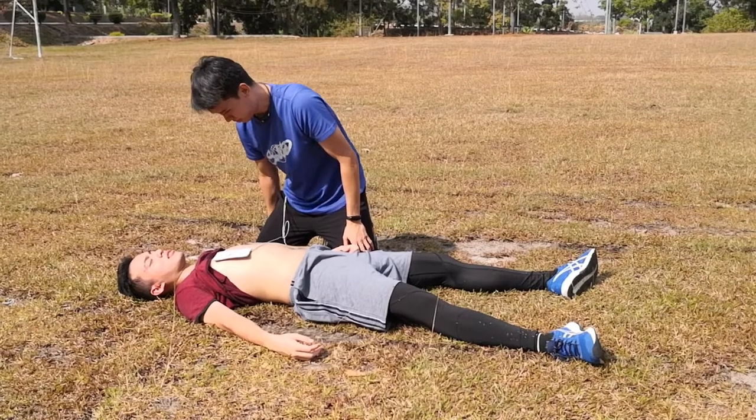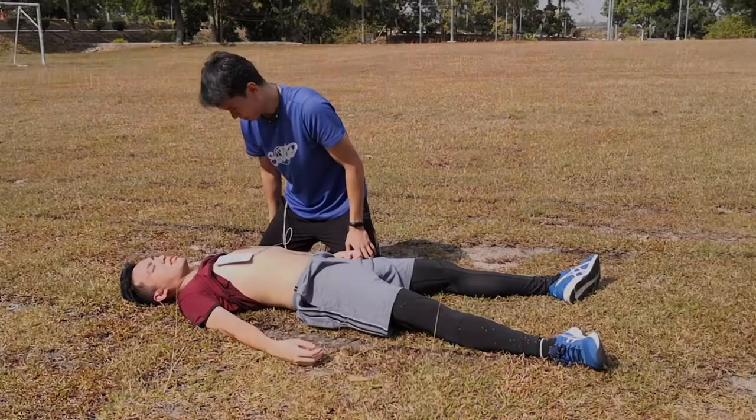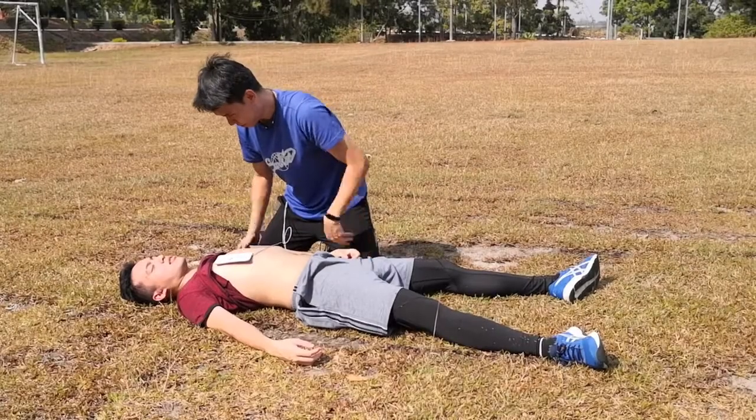Shock will be delivered in 3, 2, 1. Shock delivered. It is now safe to touch the patient.